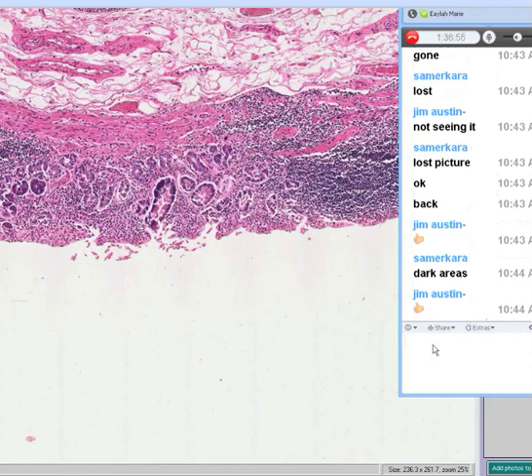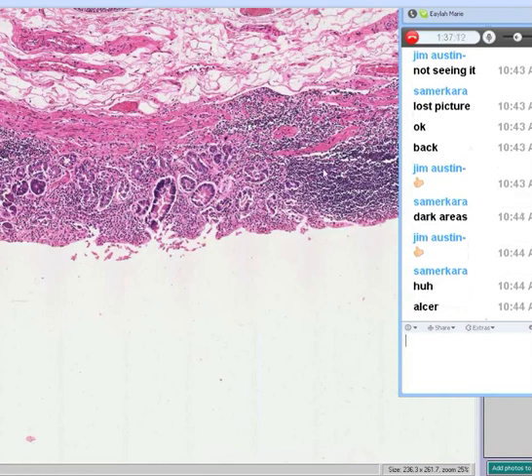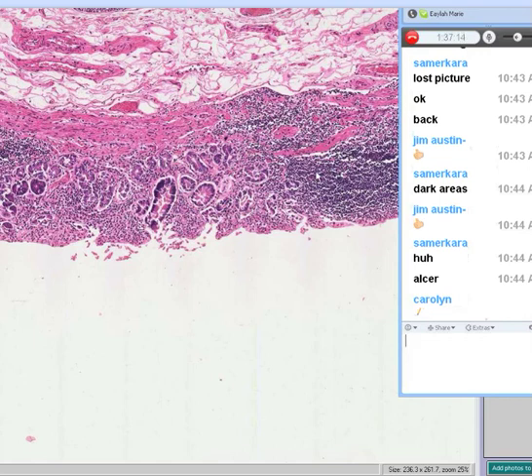This is a diagnosis that you should have been able to make on day one of this pathology course, because you know what stomach looks like histologically, and you know that when you see these lymphocytic or chronic inflammatory cells disrupting the muscularis mucosa, disrupting the lamina propria, and forming these little nodules.